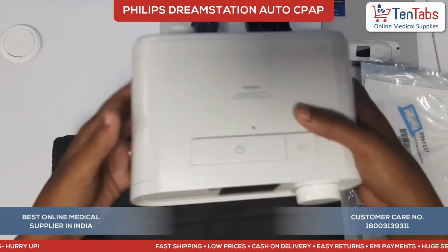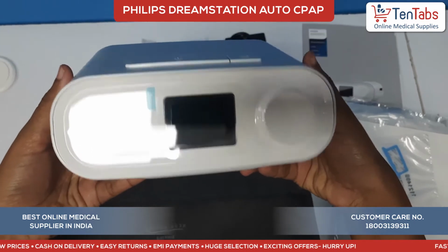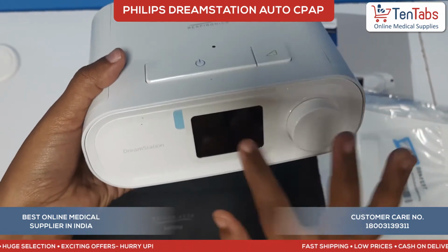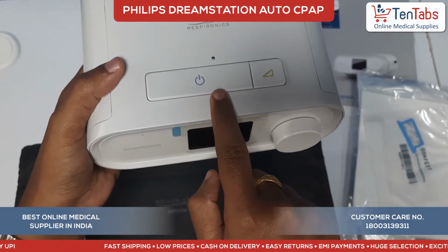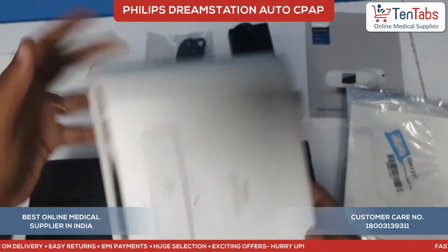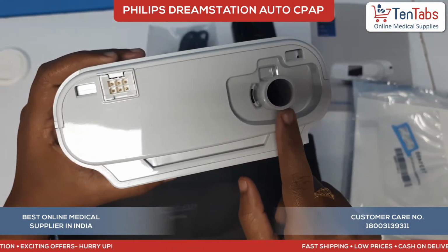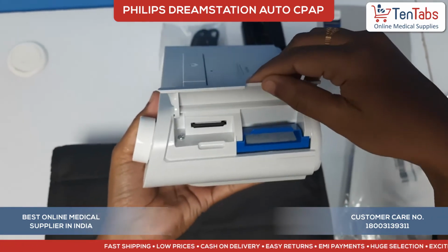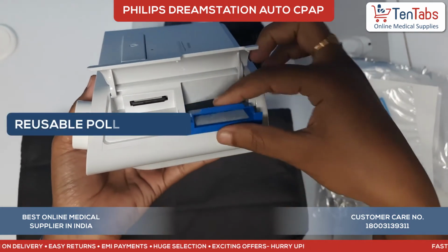And here this is the device itself. The front panel contains the rotating knob and the display screen. Next you can see an on-off button, therapy on-off button, and this is the ramp button. If you see behind, this is where you connect the hose pipe, and here in the side you have an SD card and a reusable pollen filter.